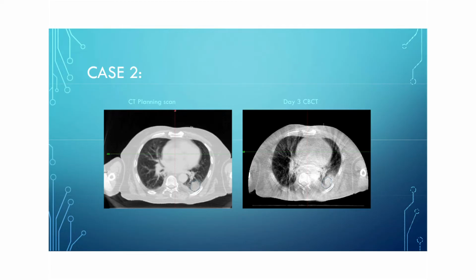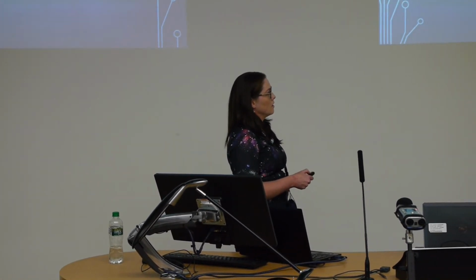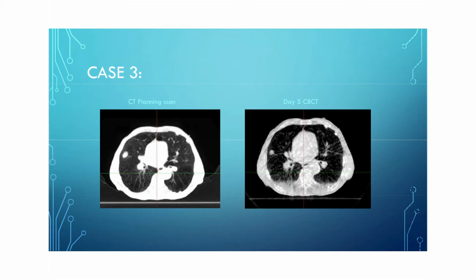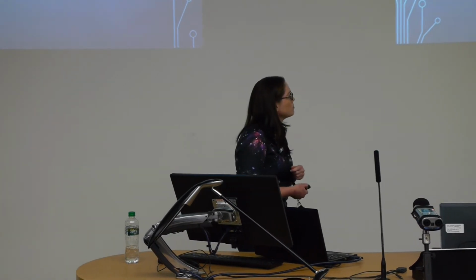There's another one. So you have this nice CT planning scan, and then you go to treat the patient and their tumour has moved. So now what we can do is you take this planning scan and this scan that you've taken on the treatment bed just before you treat the patient, and you use image registration techniques. So you essentially shift what you planned here over to this, so you're tracking your tumour daily. And the big benefit of this is that then that margin of uncertainty has come down. So you don't have interfraction uncertainty from one day to the next because you are moving to match that tumour, so you can now treat a smaller area. So ideally you're going to treat less of the normal tissue.